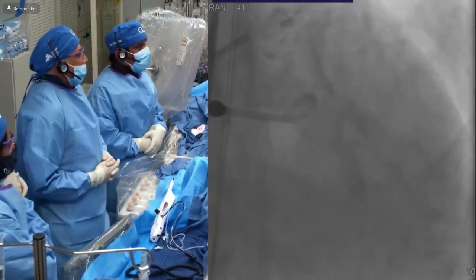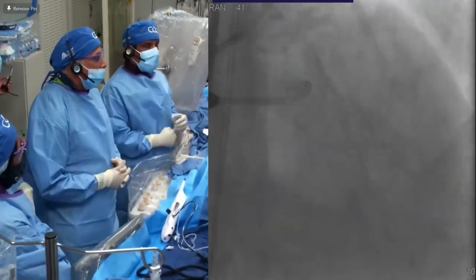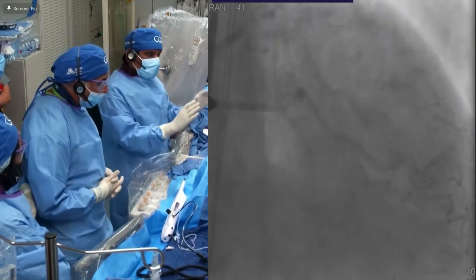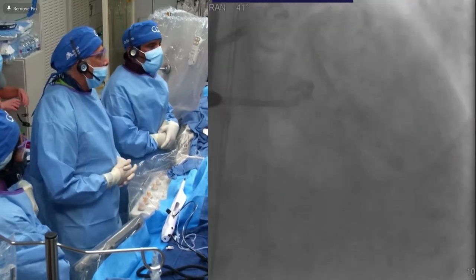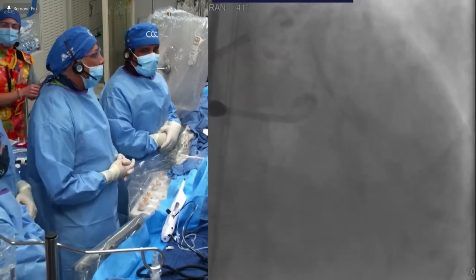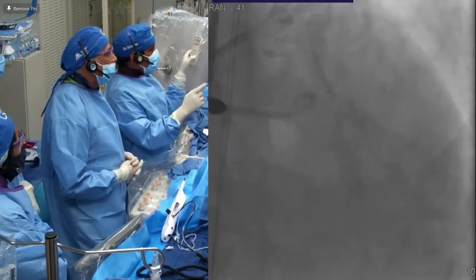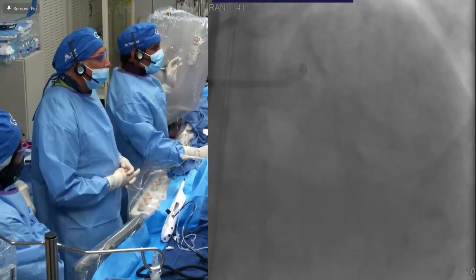But this tortuosity - we felt this is a good case. Despite EF around 50%, it's not a classical less than 35, but 35 to 50 EF data have come in for complex CAD - the FDA approved Impella for these patients with mild LV dysfunction or near-normal LV function in cases of complexity like this. If perforation occurs or anything else happens, surgical opening of the chest will be very, very difficult. So we need to stabilize this patient, and therefore we had placed the Impella - because of the complex CAD and knowing that our options are limited. This is appropriate from the AUC point of view.